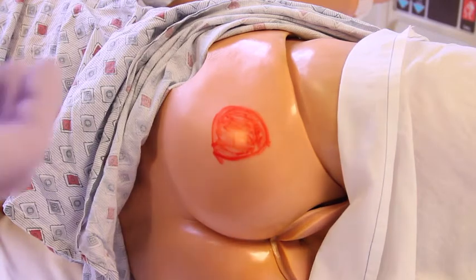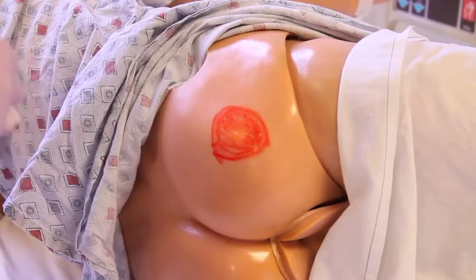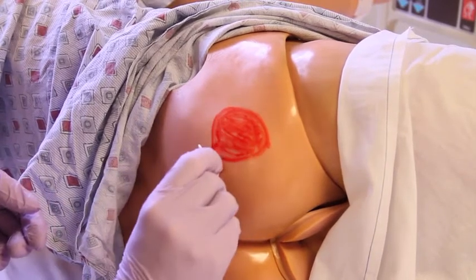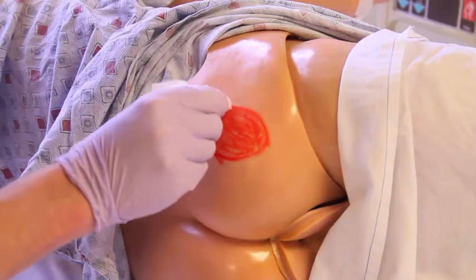After you've performed your hand hygiene and applied a new set of gloves, you're going to clean the wound. You want to make sure you have a clean gauze for every wipe that you make. You're going to put it in the appropriate solution, and then grab it and go top to bottom and inside out. So you're just going to grab it and wipe away. And you're going to grab a new one and do the same thing. Top to bottom, inside out.